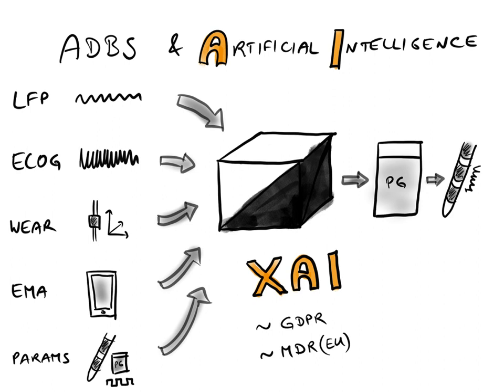And for this kind of work, in which there is no human in-between action, on one side there's quite a strong voice for optimal performance, even if it means black box. On the other hand, because you will be directly influencing the function of the brain, explainability will be very important. So this is one of the things I actually don't have an answer to.